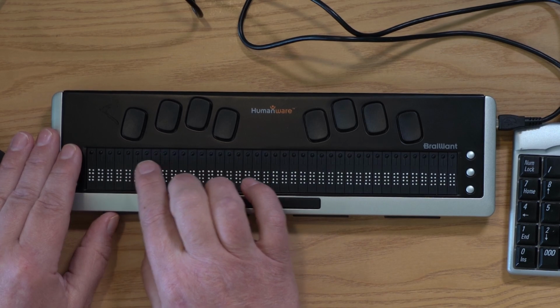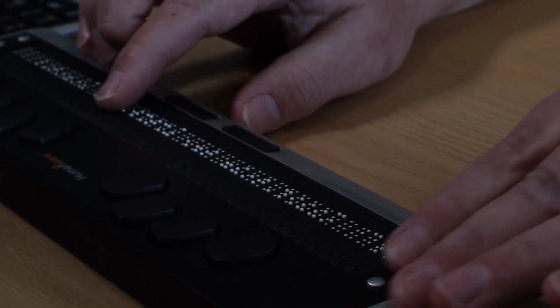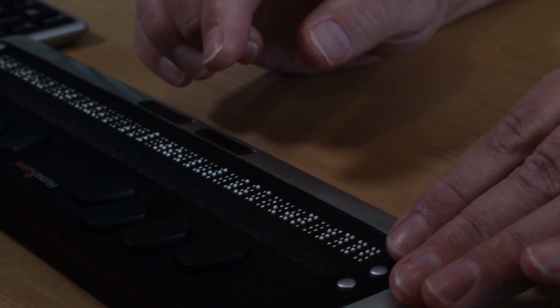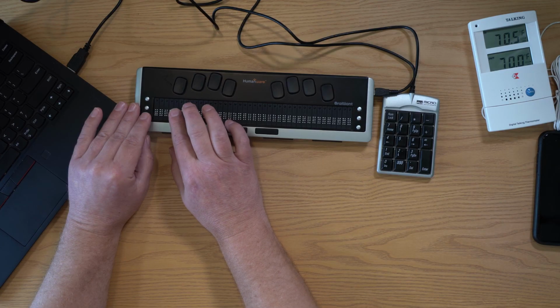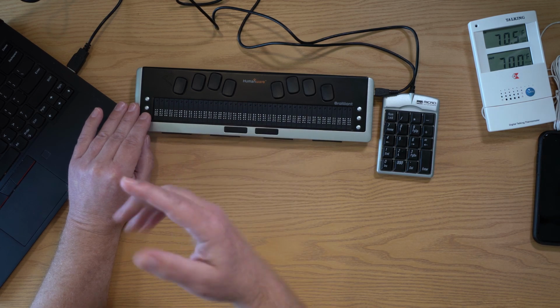And here I can read it, innovating the future. And I'll go down a line, and watch the pins will go down, and new text will come up. The AFD Talent Lab aims to meet the accessibility needs of the tech industry and millions of people living with disabilities and through a unique combination. So I can read that with Braille or the speech.